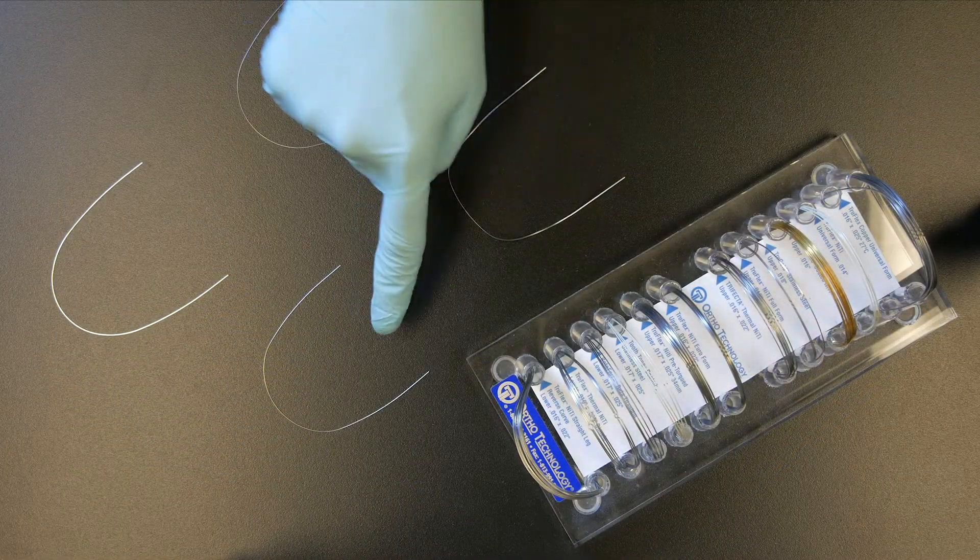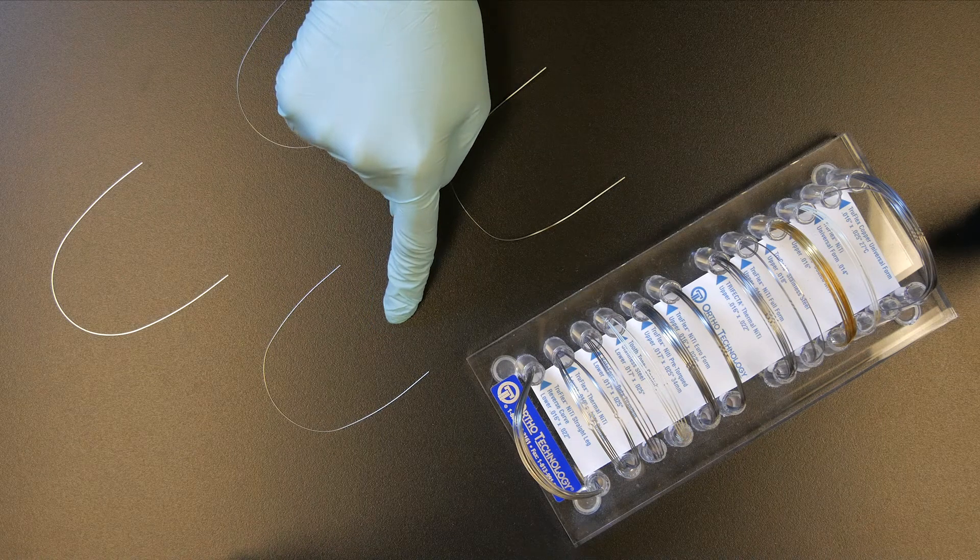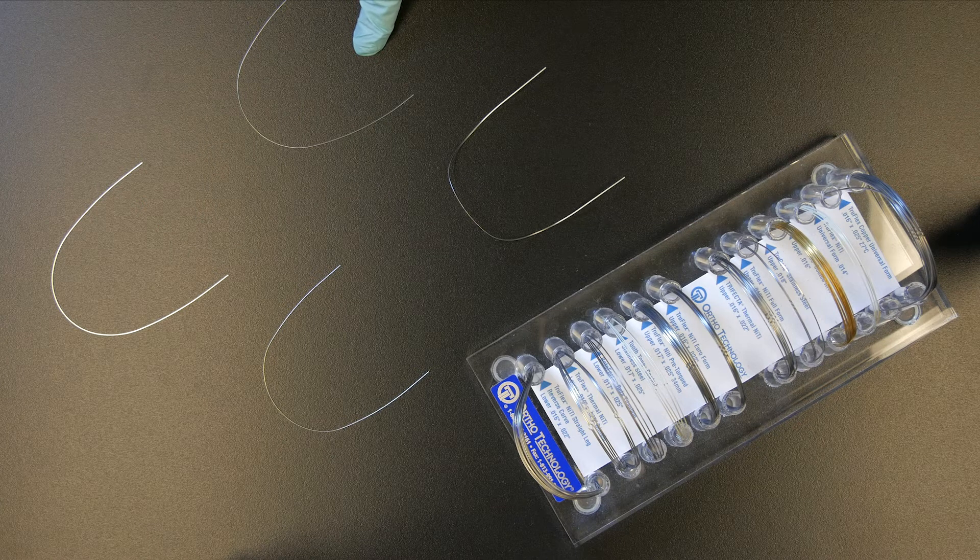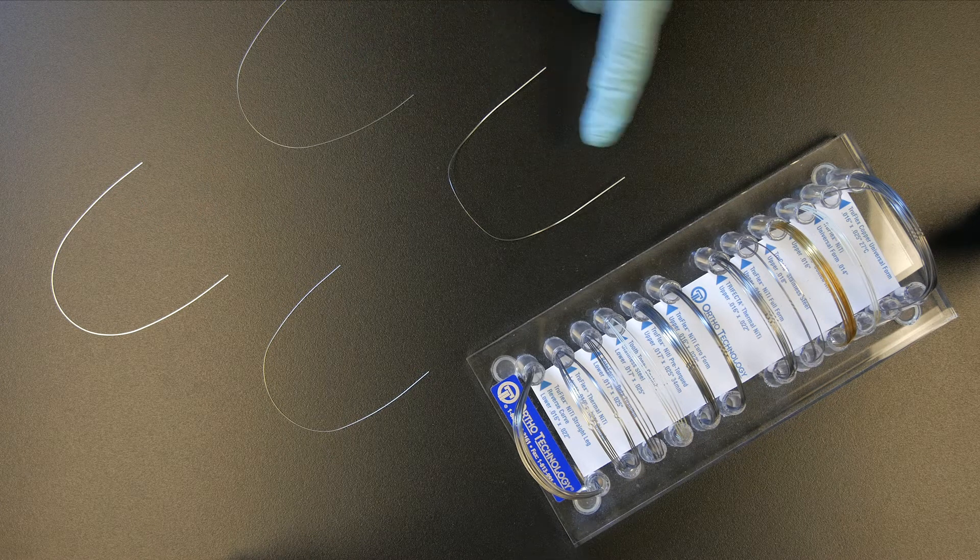We offer this wire in a full form which is a more natural shape, a Euro form which is a more narrow shape, a universal form which is a more broad shape, and the reverse curve of speed.